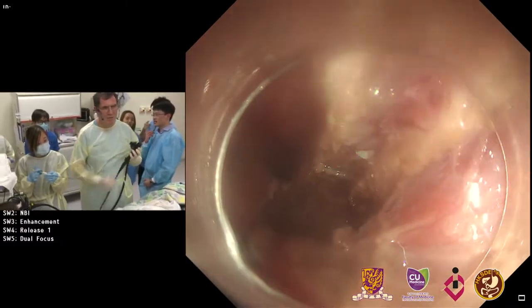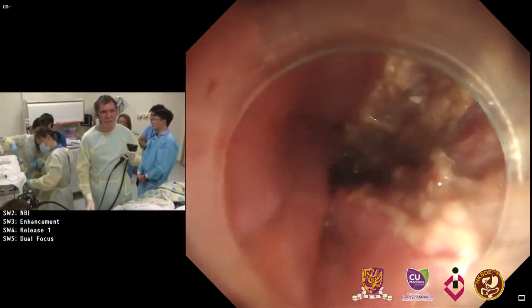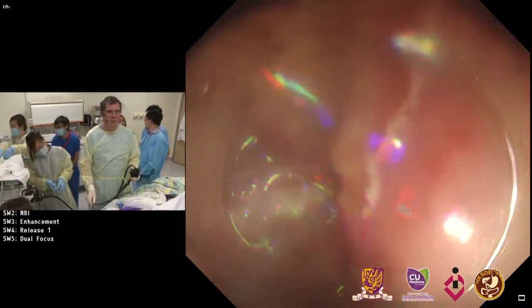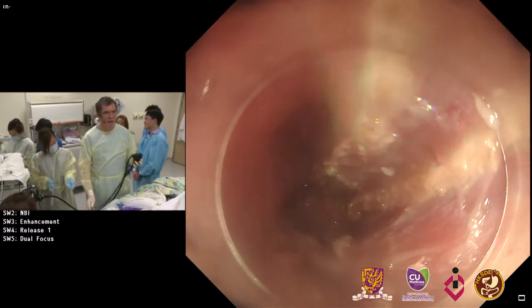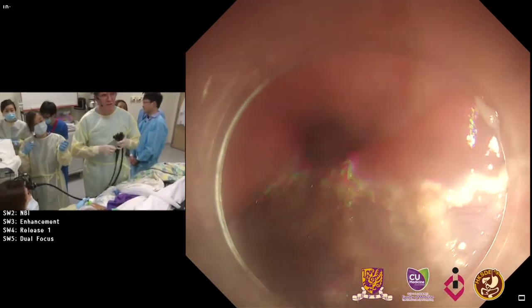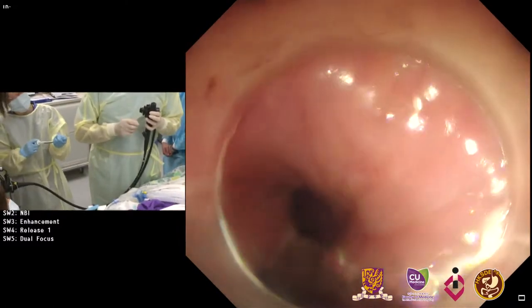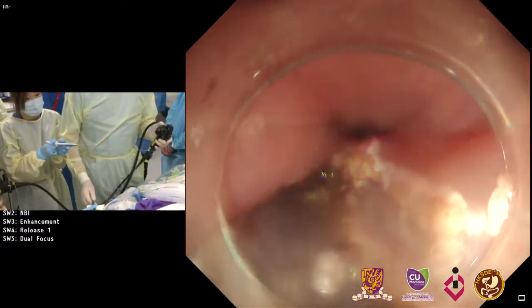We'll take some clips now. It's a little bit asymmetric, and the visibility is a little poor with this kind of tube. I'll start with some clips at the bottom and check whether we need more than three or five clips — usually that's enough. The patient won't have any problems with the clips regarding dysphagia.